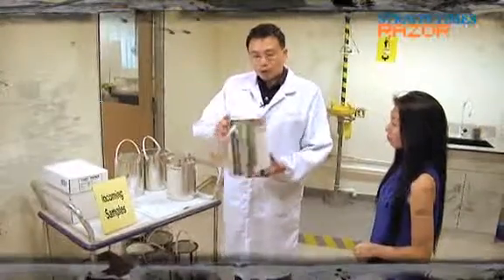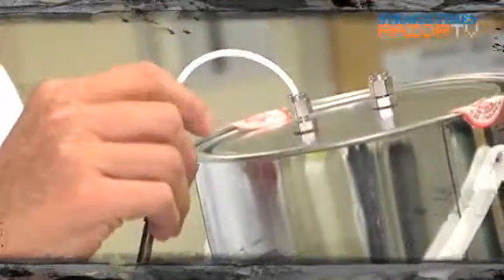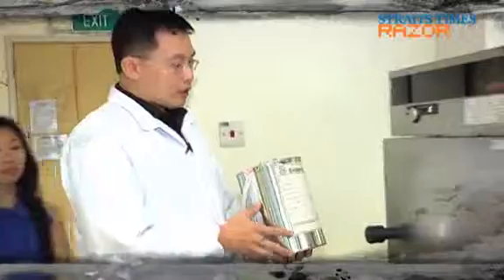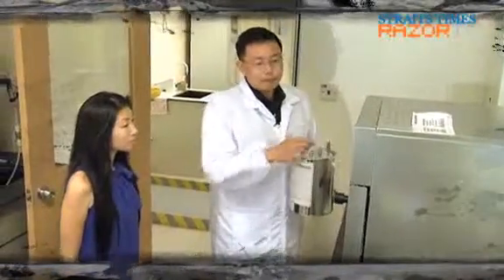So what we do once we receive this tin, basically we need to change the lid. Okay, so we change the lid with an absorption tube. Basically this test requires us to extract the vapor inside the fire debris into this absorption tube. So once this lid has been fit onto the tin, we will heat up the tin. Basically, after fitting in the lid, we need to put it in the oven to heat up.